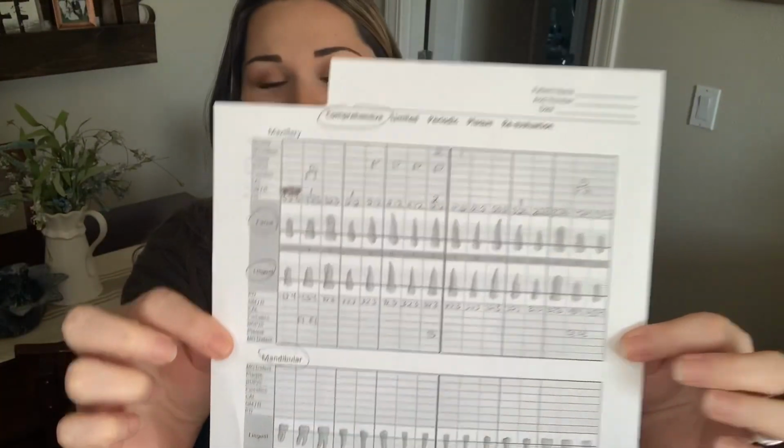So I have this piece of paper here, and I'm going to insert a clip later in the video of me filling this out and explaining how to fill this out. But I wanted to talk about some things on this piece of paper real quick. This was used before there was digital charting, but it also is still used in offices if you want to fill it out beforehand and then enter it into the computer. But you do want to get rid of this paper afterwards because you don't want to leave a piece of paper sitting around with patient info on it. So you want to make sure that you put this in the shredder afterwards.